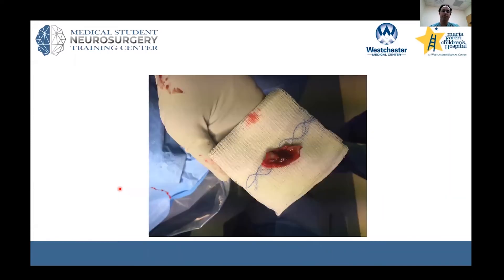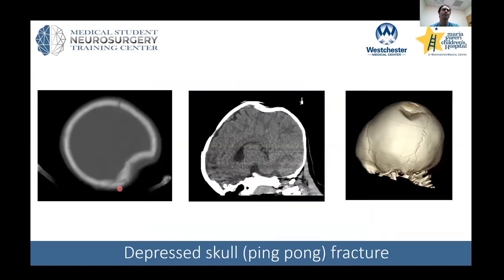He was taken to surgery due to this fracture being open and depressed. There was an impacted piece of bone that we removed, and we simply placed a mesh over the defect. The fracture here is a little more pronounced — we call this a ping-pong fracture, as if you took a ping-pong ball and crushed part of it.